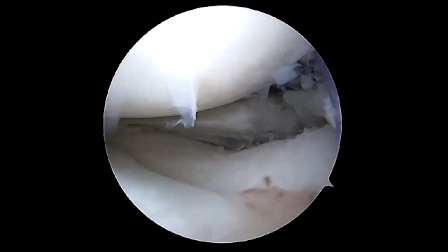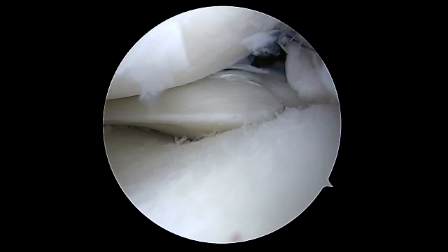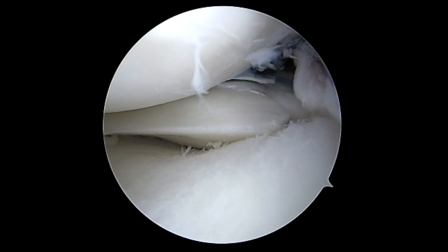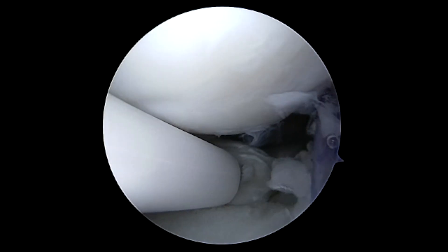Following this, we've passed our ACL graft. You can see there is no further anterior drawer. We'll then turn our attention, after completion of the internal brace, to the repair of the root slash radial tear. You can see here we're sequentially tightening this with a swivel lock.